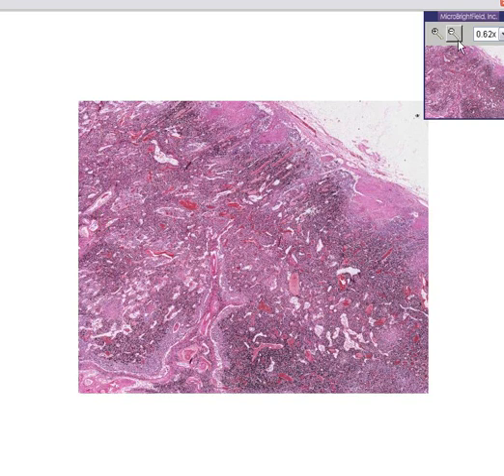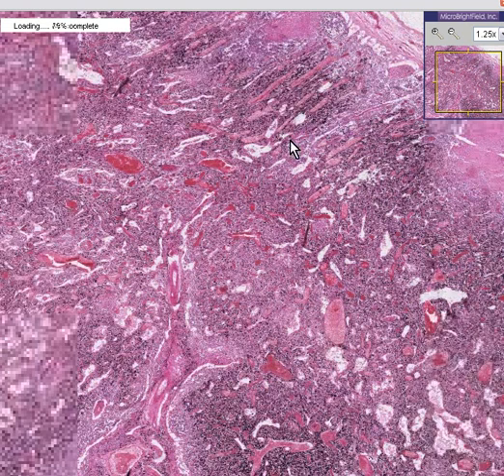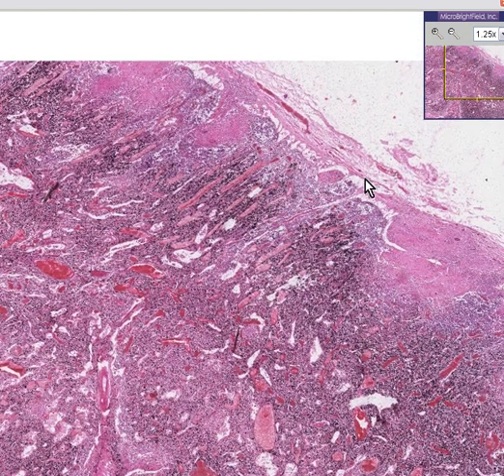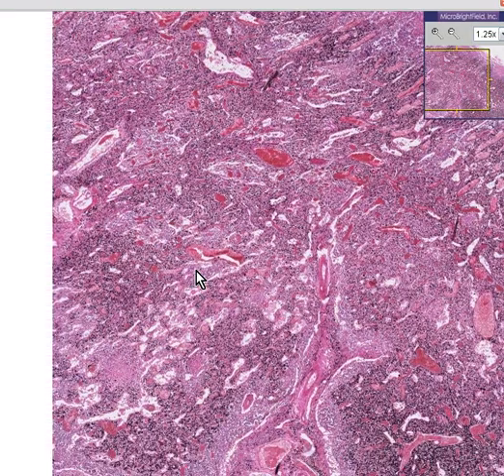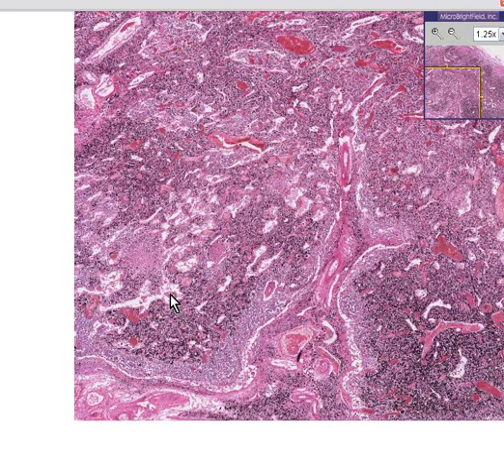Here is a lymph node. You can recognize it as a lymph node because you can see a capsule, a subcapsular sinus, subcapsular follicles, and within the medullary portion you can see medullary sinuses and medullary cords.